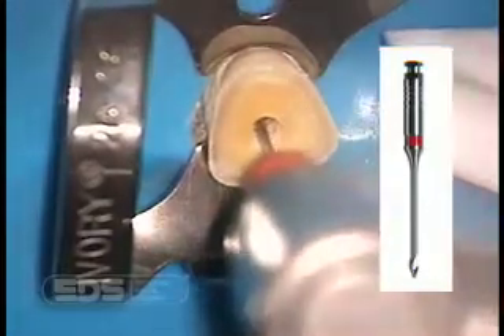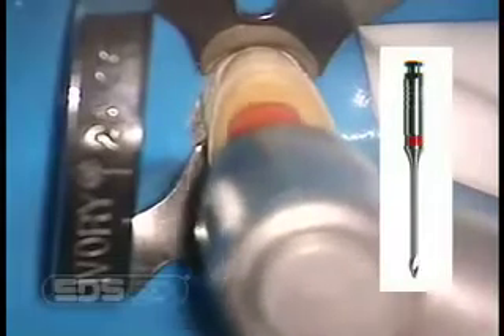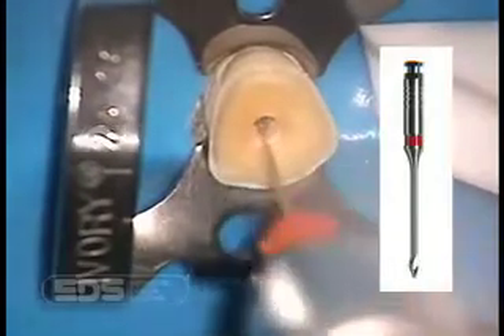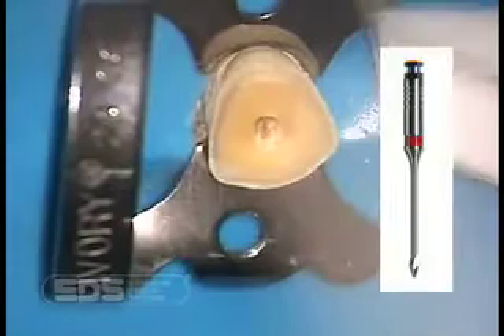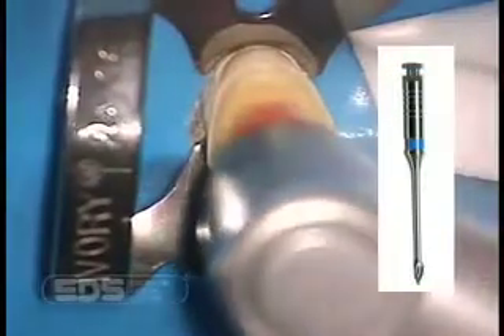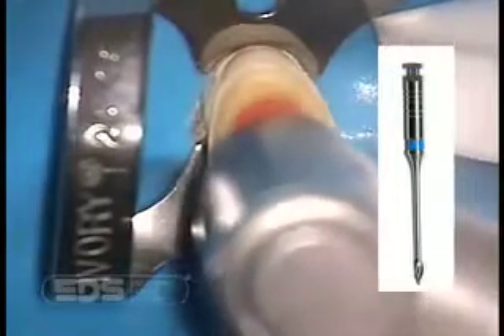Post hole preparation begins with removal of root filling material using EDS color-coded Gates Glidden reamers. In sequence, a non-end cutting EDS Gates Glidden reamer is used until 100% of the post hole length and 90% of the post hole width are established. You know you have established the correct length and width when the last Gates Glidden used is the same color as the primary reamer of the chosen post.